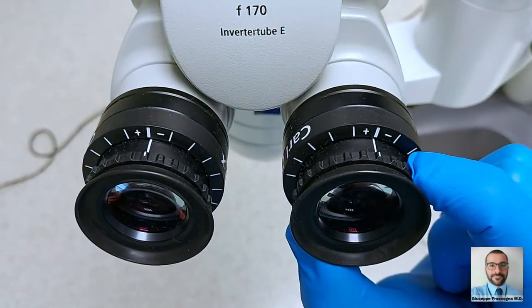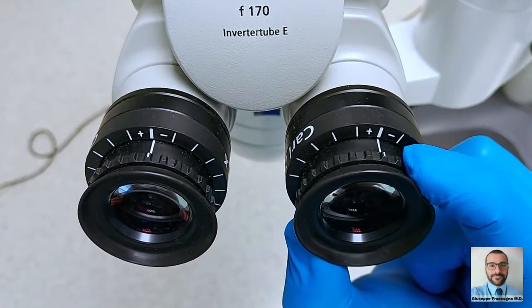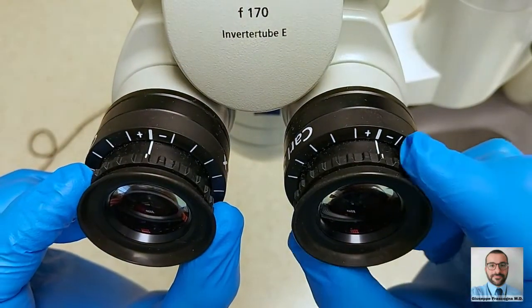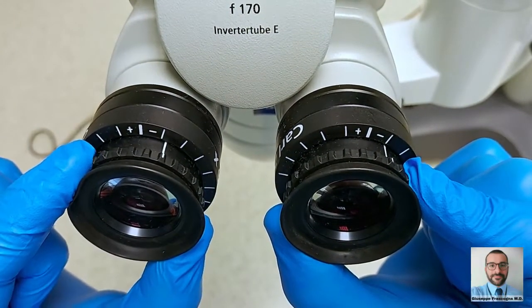Each eyepiece has a diopter regulation ring to set the personal spherical refractive defect. If you use your glasses or contact lenses, it is better to set on zero, although young surgeons with a large accommodative reserve sometimes find a slightly negative setting more comfortable.